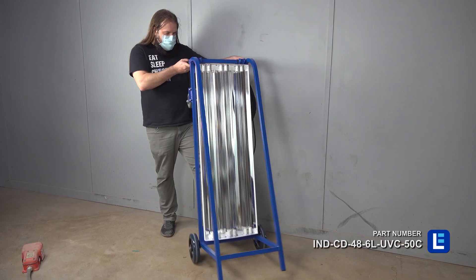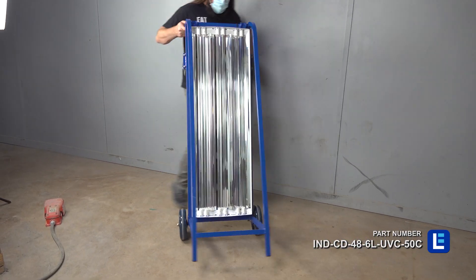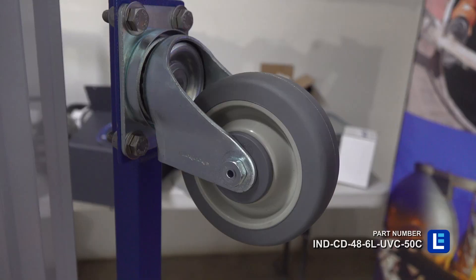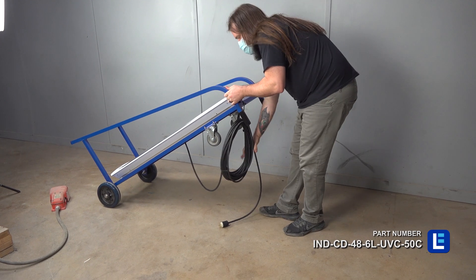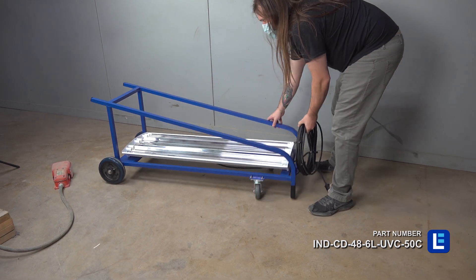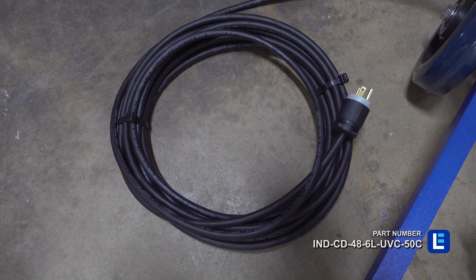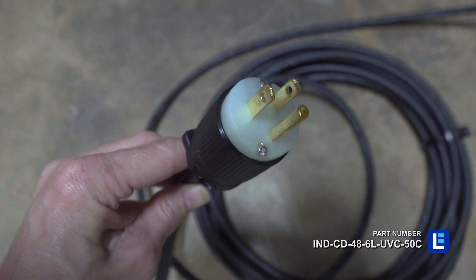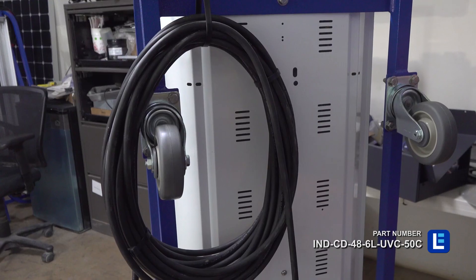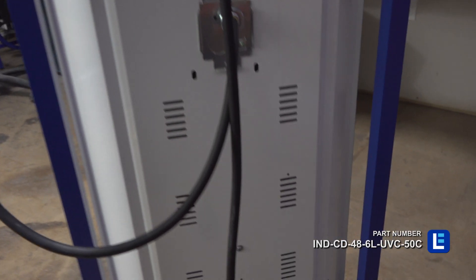The cart allows the entire fixture to be easily wheeled into position as needed. This cart comes with caster wheels and can be laid flat for sliding the cart under vehicles or into hard-to-reach areas. This unit is equipped with 50 feet of 16-3 chemical and abrasion resistant SOOW cord that is fitted with an industrial-grade cord cap for easy connection to common wall outlets.